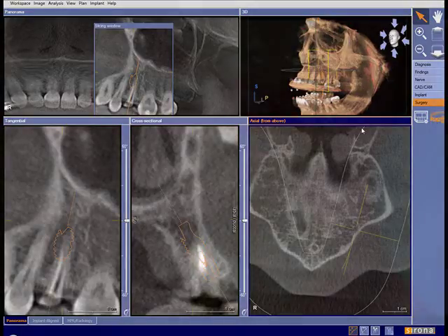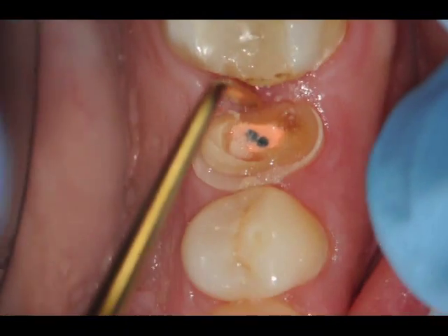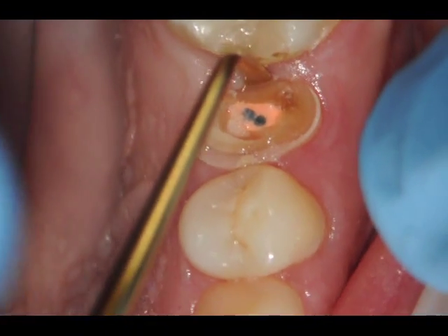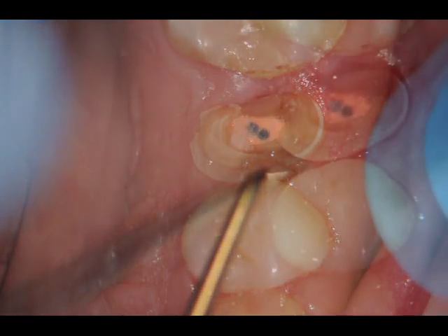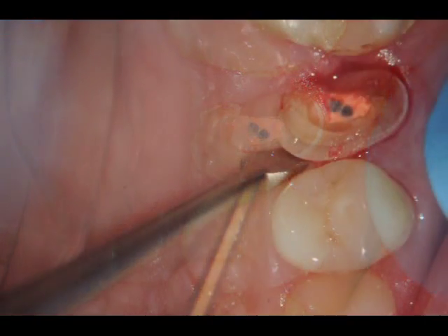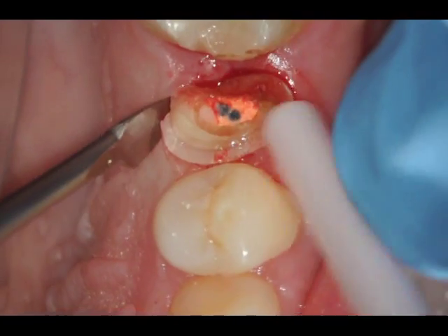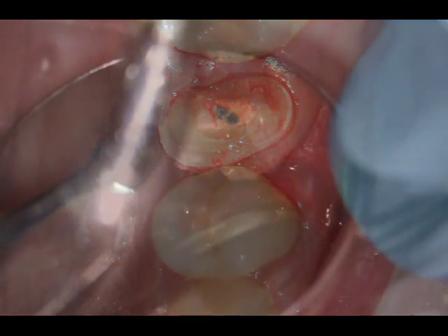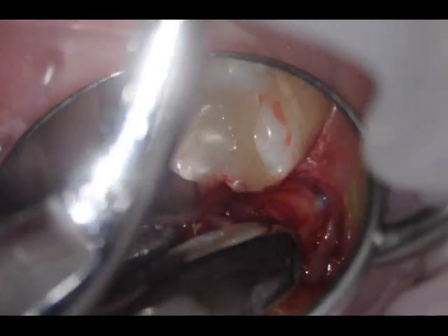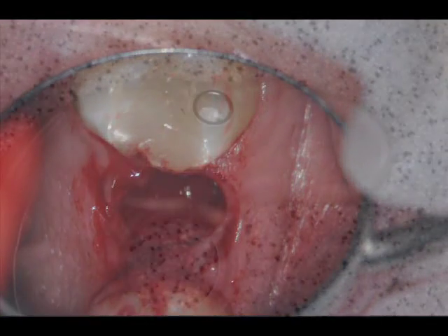The patient comes in and placing the implant is actually quite painless. There are no nerve endings in the patient's bone. As soon as the gums are numbed, it's pretty straightforward to do. Here you can see the tooth that was broken down. I'm going to gently remove the tooth, making sure I don't do any damage to the teeth next to it. The patient is completely comfortable — they don't feel a thing because they're adequately numb. There's the remaining root that was taken out.